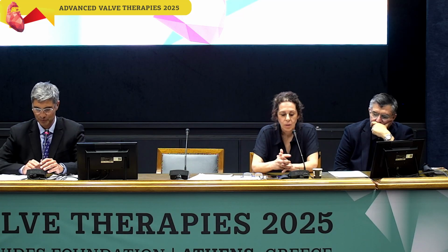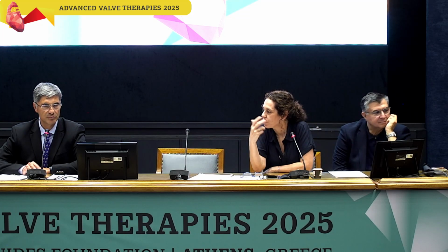Vaso? Yes, I would like to ask how many times after the first deployment of the device could you deploy a new one if the residual regurgitation is significant, other than immediately? Of course, you can place another immediately, but you can wait and see. But there's always the case that you might have a dislodgement or compromise of the metallic valve. You always have to be concerned about the metallic valve and the discs.